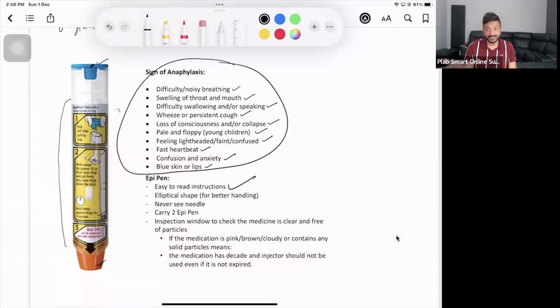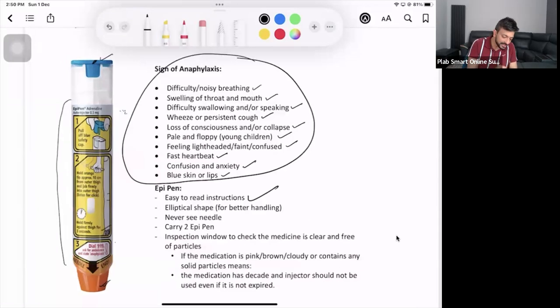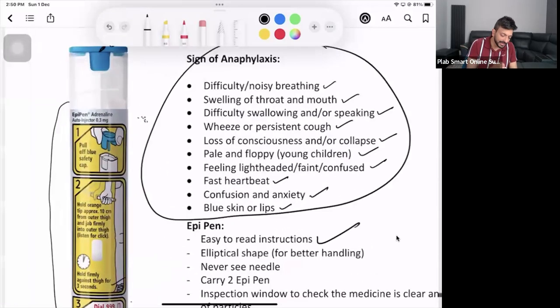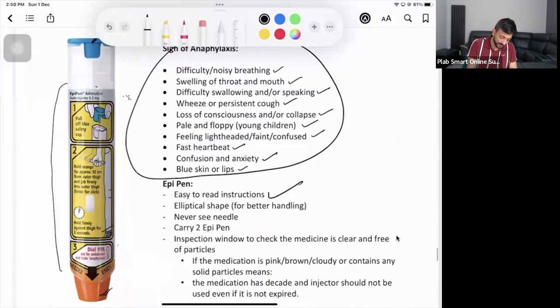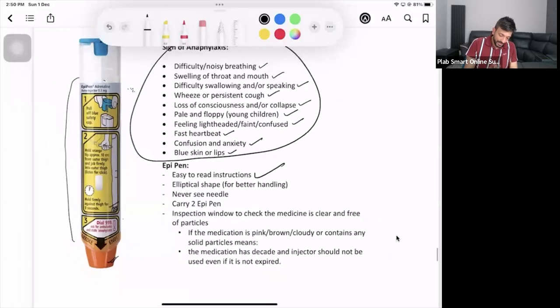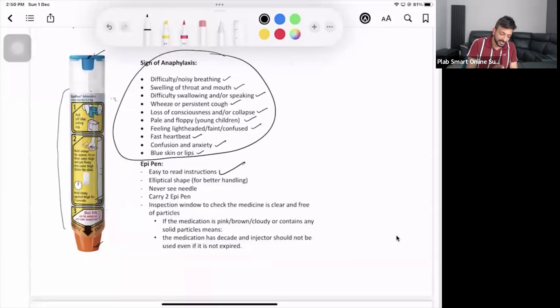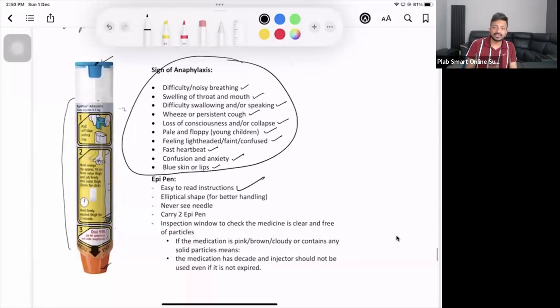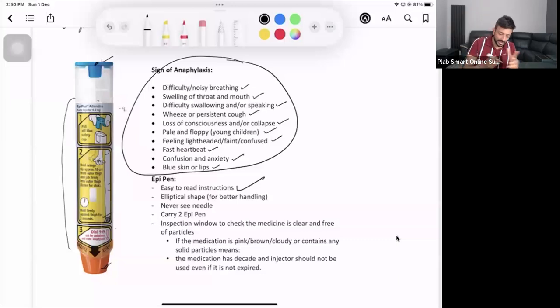That's it, that's what you need to explain. If it is the original EpiPen it will say EpiPen adrenaline auto-injector. This is the original. If it is a trainer it will be written here EpiPen trainer, so you can easily find it out. It's the elliptical shape, so you can easily hold it in your hand when you have to inject it.